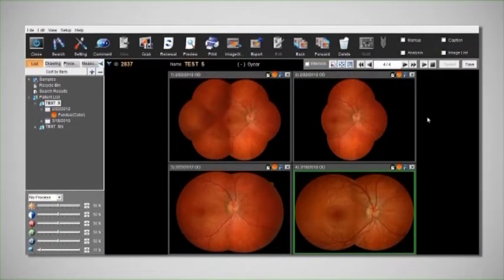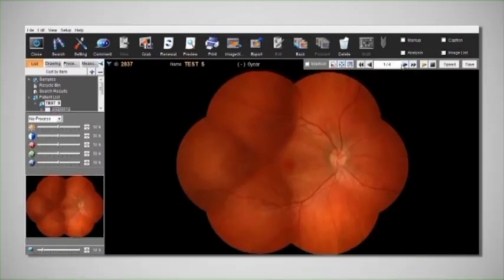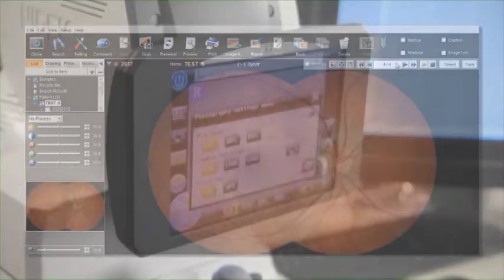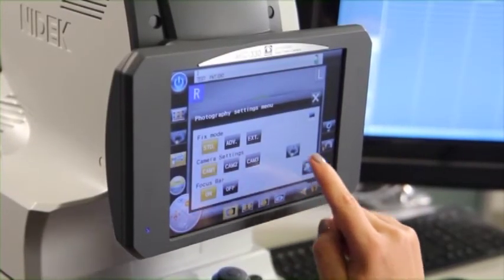Panorama images can be taken in various combinations. The operator can use the preset Standard, Advanced, Panorama internal fixation templates, or the optional external fixation. Also, the panorama setting is customizable.